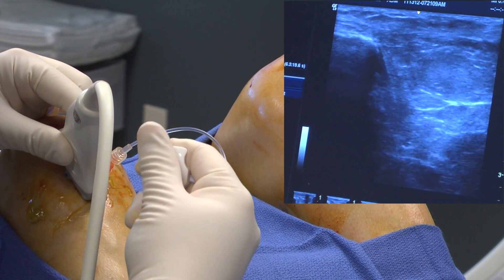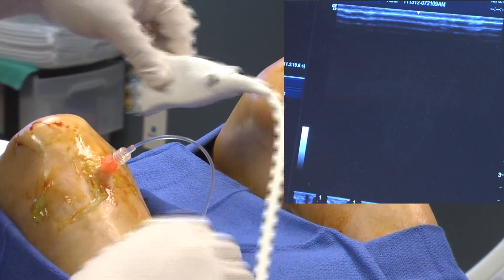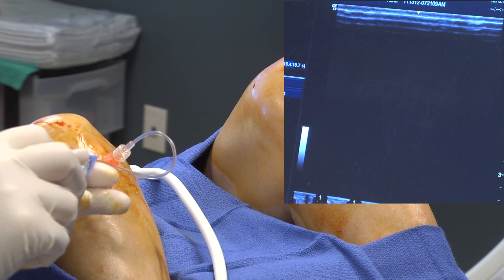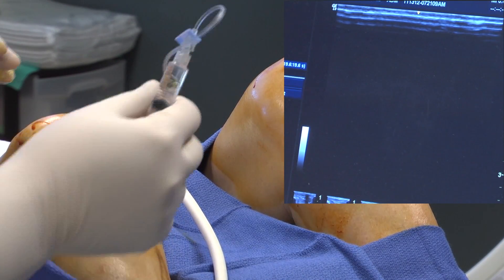Ultrasound or x-ray guidance is used in order to assure proper placement of the needle. The needle is advanced to the target area until the correct placement is noted. The medicine then spreads throughout the joint and surrounding tissues. This procedure generally takes less than 15 minutes.